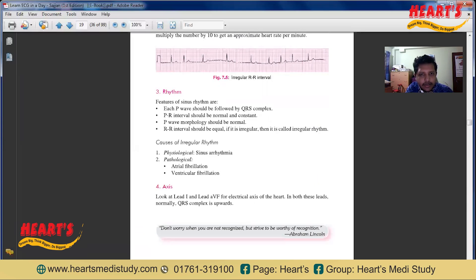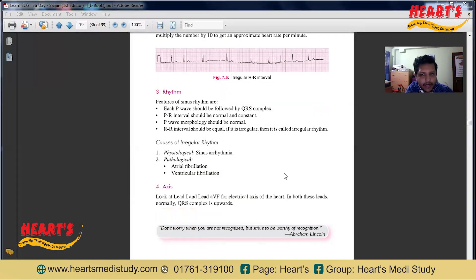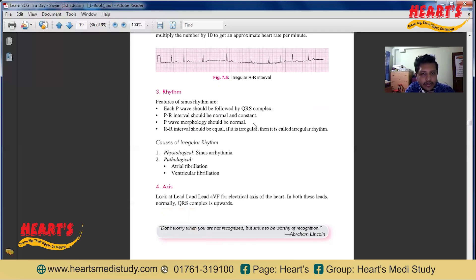Now, the rhythm — it may be regular or irregular. To detect regularity or irregularity, we look at the waves and intervals of the ECG. First, check whether the P wave is followed by a QRS complex. Then check the PR interval — whether it is constant or not. Also observe P wave morphology and the RR interval. If the RR interval is regular, the rhythm is regular; if irregular, the rhythm is irregular.